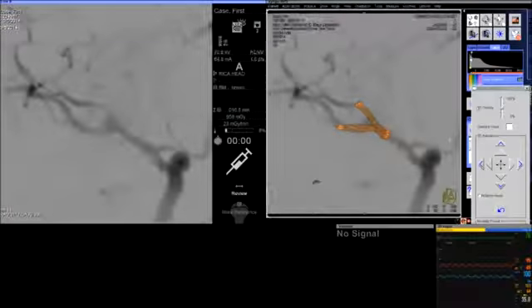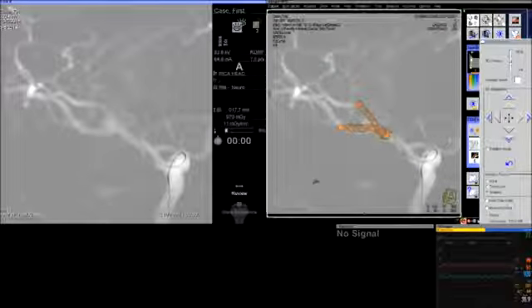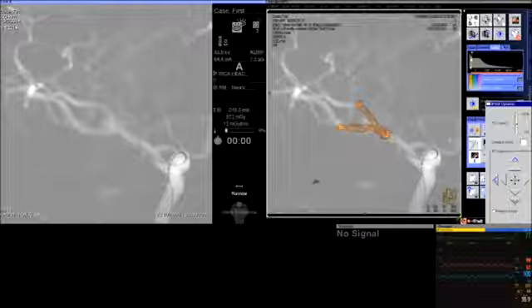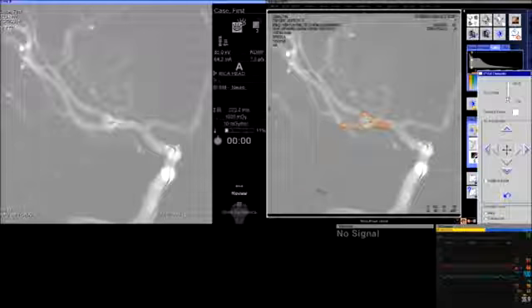So you're not doing a virtual stent, you're actually using the real Y stent construct to then overlay in your anatomy as you advance a microcatheter through the Y stent to get access to the aneurysm. One can argue that it would be okay also to place the microcatheter in parallel, but I think it's quite busy when you have to construct a Y and have a microcatheter into the aneurysm position, especially on small aneurysms like this one. So I think that this overlay technique allows you to have a nice idea of where the transition between the parent vessel that you have created with the Y construct and the aneurysm is.